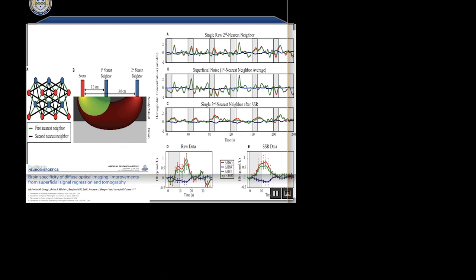Yeah, if you just take the global average and use it as a regressor... There's concerns about the exercise research, like are we just measuring skin blood flow? With movement-related fNIRS, it's particularly difficult and an issue. What you actually want to do, I don't think it works. I mean, yeah, it is fair, and it is particularly difficult.